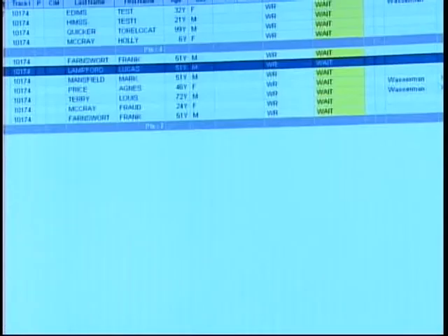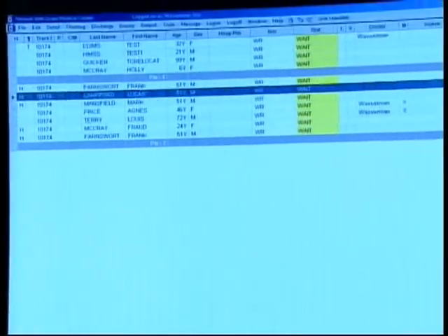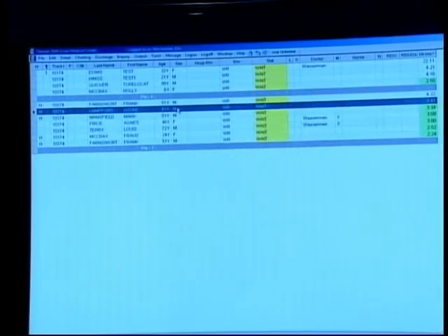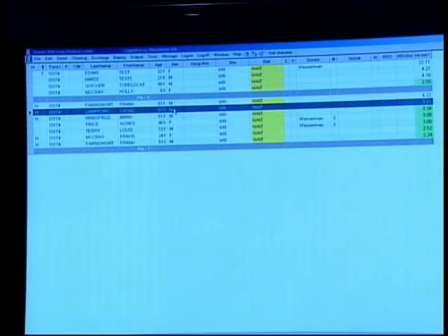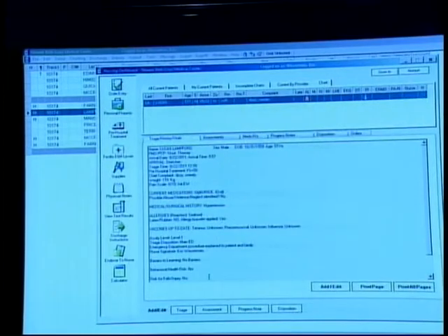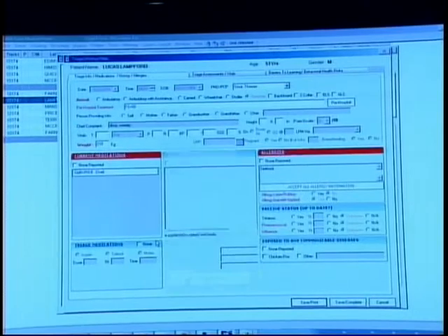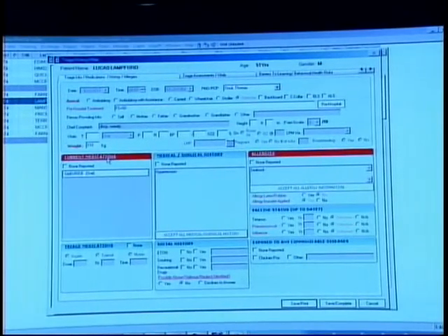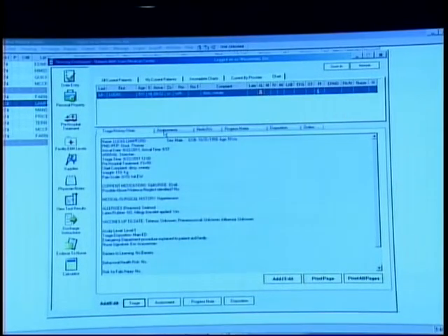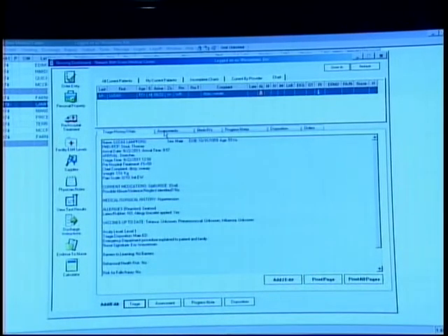We receive in our HIMSS application, which is our emergency room application, an ADT message registering that patient within our system. Our nurse would go through and triage the patient, which we've already provided most of the information in there, but they'll go through, enter vitals, pre-hospital treatment, current medications, medical surgical history, allergies, etc. They would go through and save and complete that screen. This was taken from the patient? This is taken from the patient by the nurse during the encounter.